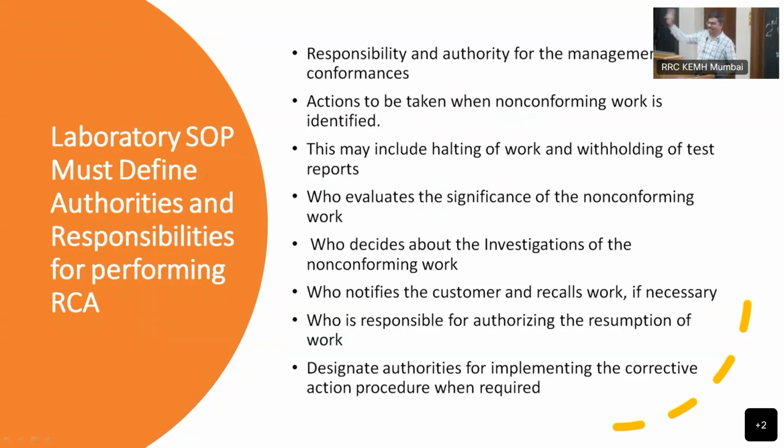It gives some bizarre results, but by the time when it is out and again reloaded, it attains all the qualities of a good quality QC material and it gives good results. So, I really question, is our IQC plan just to check the QC stability or probably checking the integrity of the QC material.